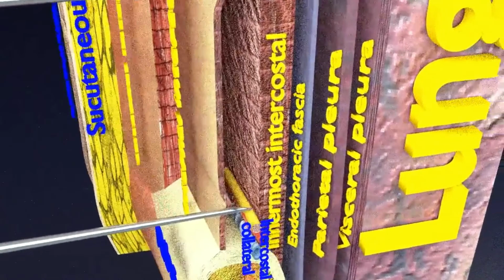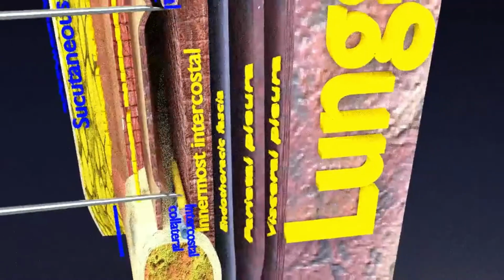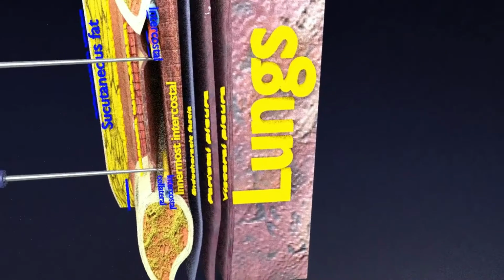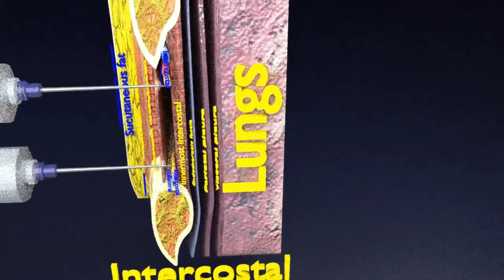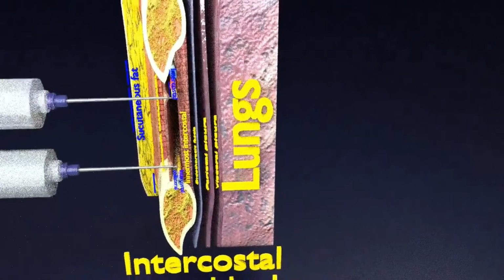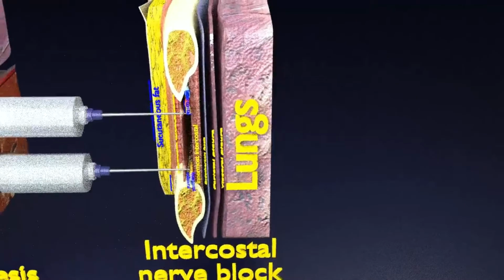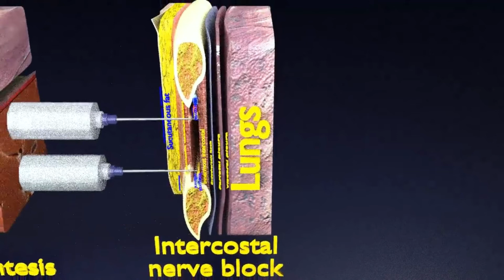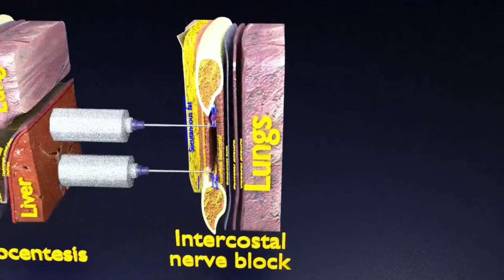Usually, it is preferable to block two proximal and two distal adjacent nerves to the selected level simultaneously to cover all the areas affected by the surgical incision. Then, after that, 15 to 20 milliliters of 1.5% xylocaine is injected. Use X-ray guidance to insert a second needle and inject steroid pain medications.